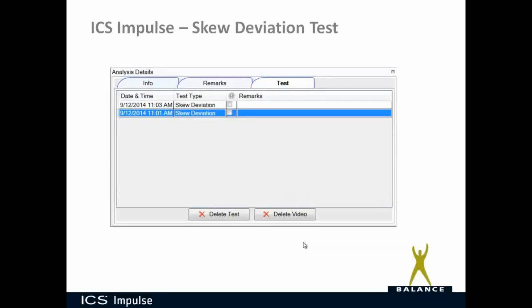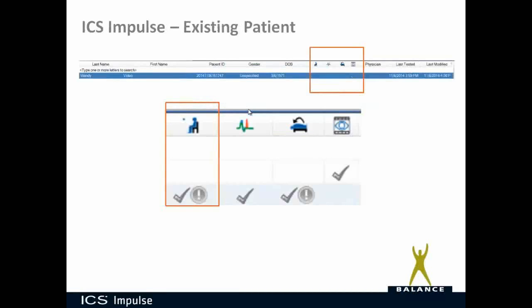If you go to the Test tab, you would have a list of all your tests — every time you did a skew deviation test it would be listed there. You can also go into the Remarks tab to add remarks about what was unique about that test. If you have an existing patient, the skew deviation test is under Ocular Motor, denoted by the icon of a person in a chair staring at a dot. Next to the patient's name in that column, there would be a check mark indicating an ocular motor test was done.